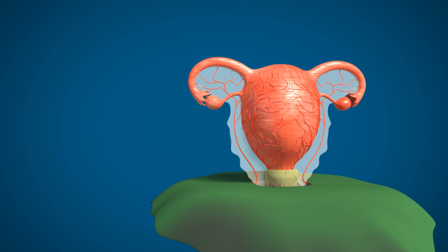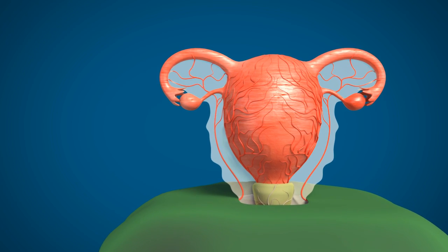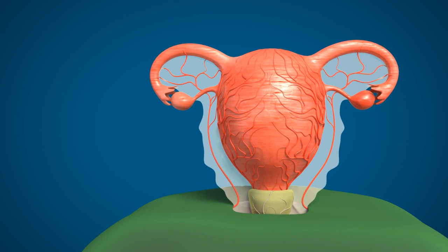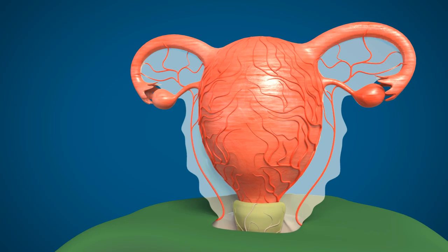Here I am demonstrating a special hemostatic suturing technique for caesarean hysterectomy without blood loss. This is the postpartum uterus exterior. You can see the engorged uterine vessels and their branches as well as the ovarian vessels.